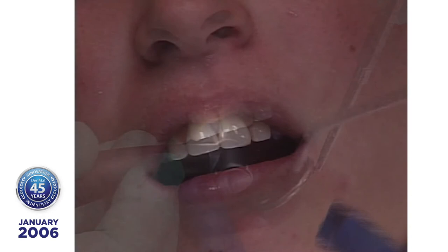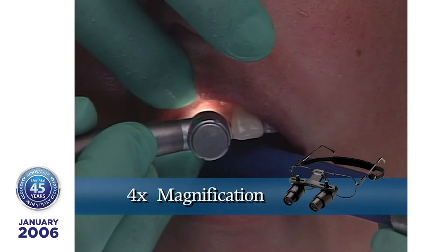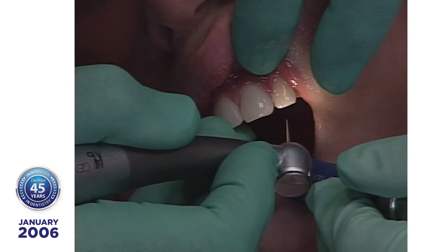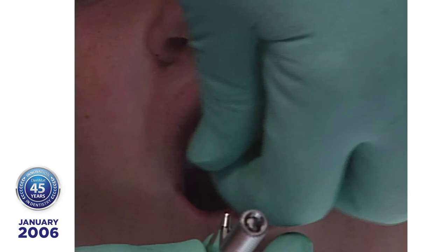4-power magnification is essential for this technique, as smooth, seamless margins are necessary for an aesthetic appearance and long-term periodontal health. Because the lumineers are bonded without the use of matrix strips, the interproximal contacts have been fused together. It is very important to open these contacts. The gross excess is removed using the 12-fluted burr, and the contact is opened through the use of a Sarasaw, an interproximal dental tool.